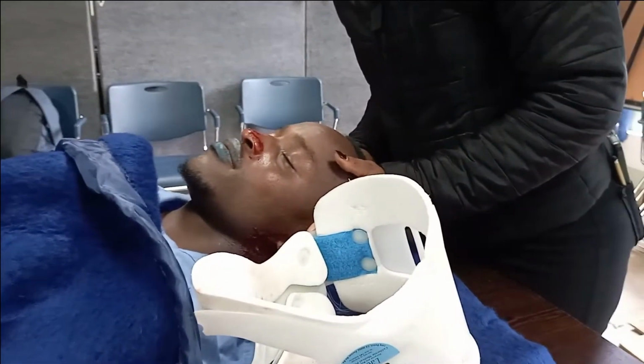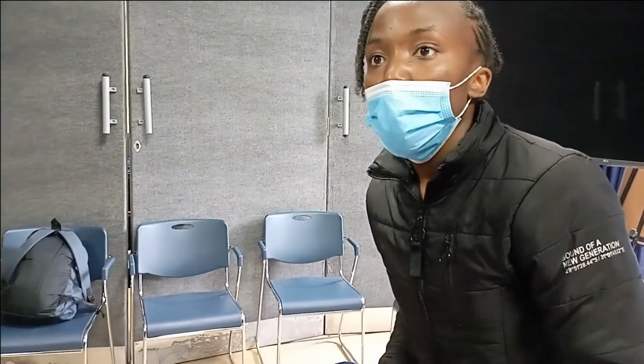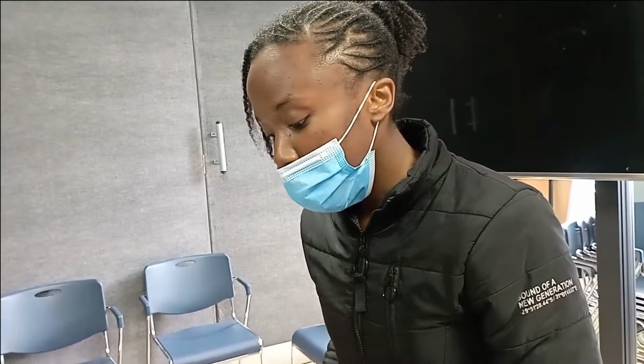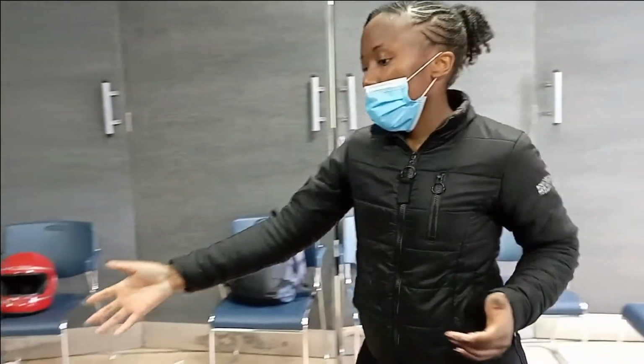At this moment, do we have our ETT? ETT equipment has been brought. What do you need? I need us to pre-medicate the patient with muscle relaxants. Meanwhile, he's still on supplemental oxygen. Muscle relaxant has been given. Yes, so assist me with the size 7.0.